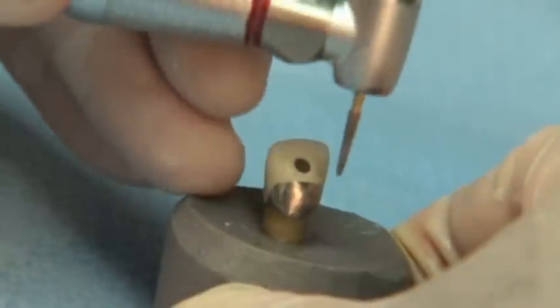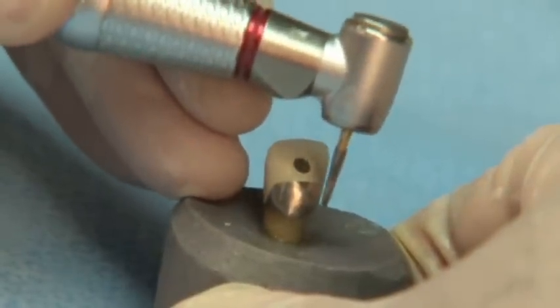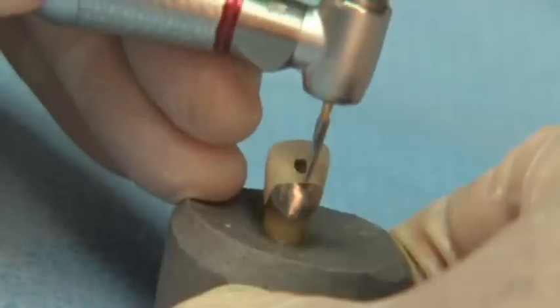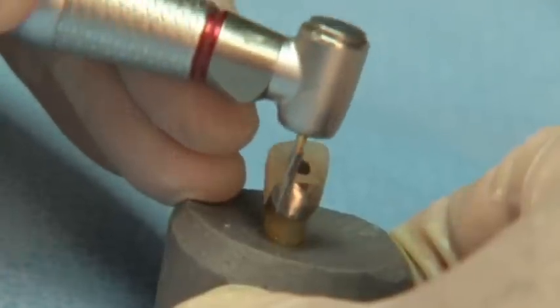After initial endodontic access has been created using the Great White series of burrs, the EndoSafe end instrument can be introduced into the tooth.